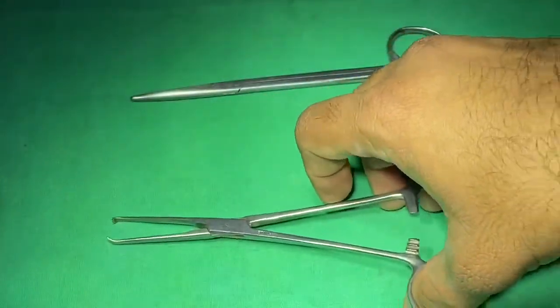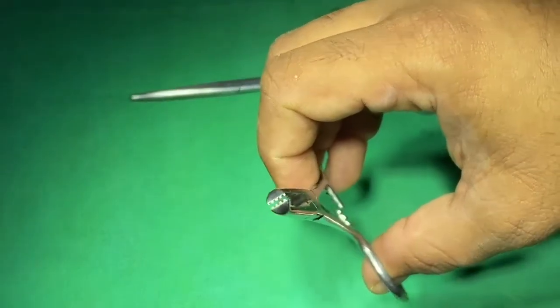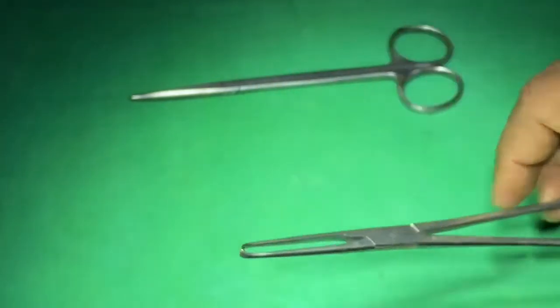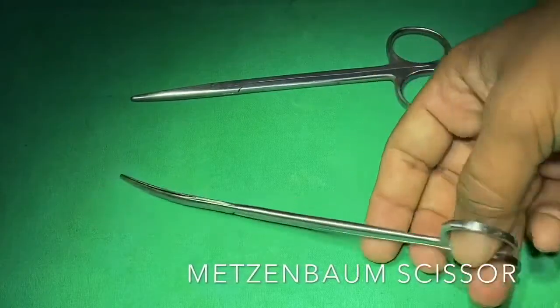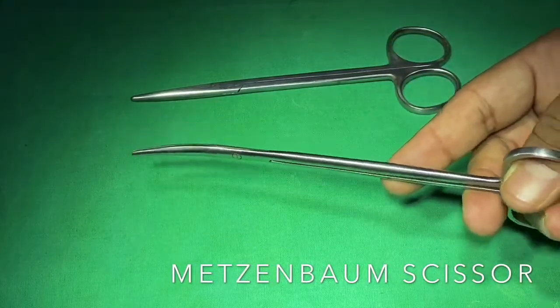This is an Alice forceps, which has a zigzag kind of mouth. It is used to hold harder structures like aponeuroses and skin. This is a Metzenbaum curved scissor, used to handle tissue — to cut or trim the tissue.